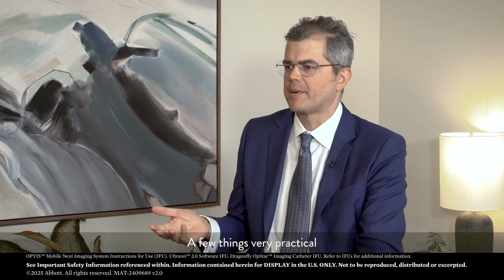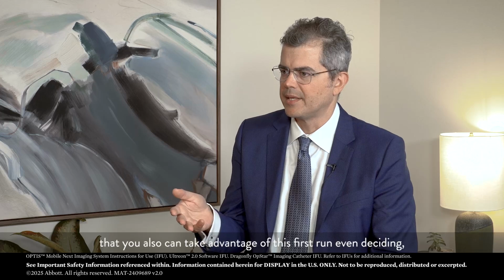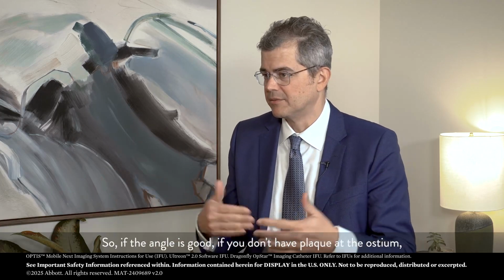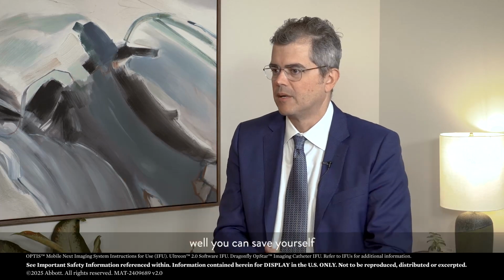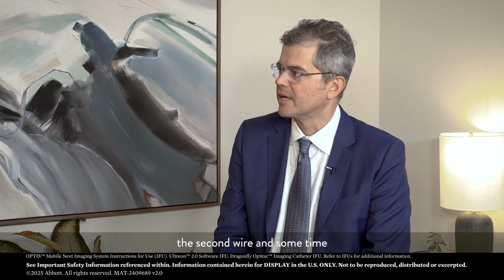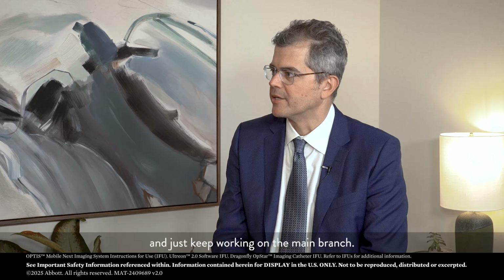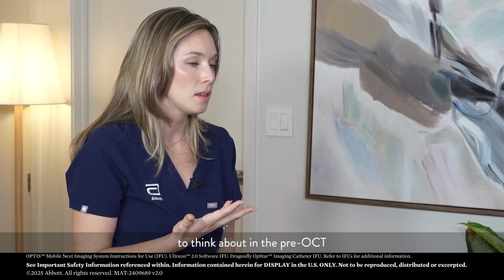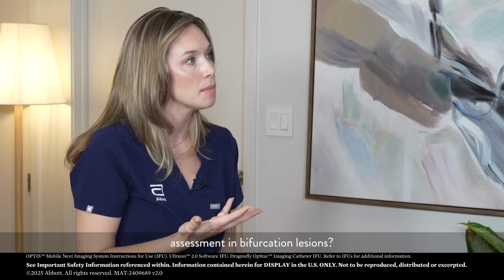There are a few very practical things you can also take advantage of in this first run, even deciding whether or not to protect that vessel. If the angle is good and you don't have plaque at the ostium, you can save yourself a second wire and some time, and just keep working on the main branch. Any other scenarios or things to think about in the pre-OCT assessment in bifurcation lesions?